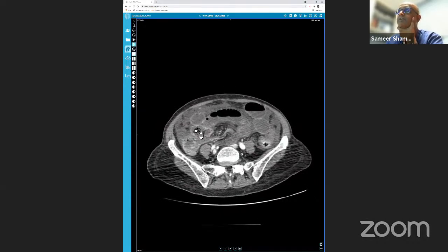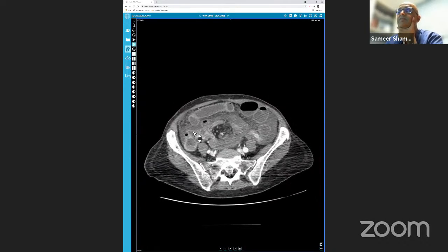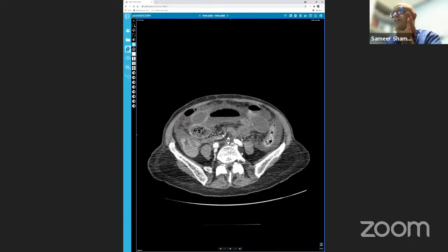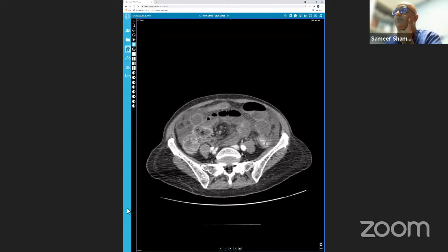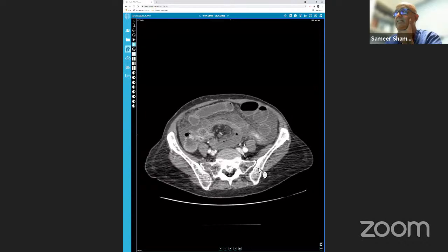This will be the game changer. Whenever you are looking at any CT scan for a bowel obstruction, look where the feces is. The transition will be just distal to it, because that's where the feces will go and sit as a dependent portion. So this is the transition, and just proximal to it there is feces. You spotted that, and that was the best part of it. And again, you can see there is whirlpooling. If you scroll up and down, you can see that's a transition.